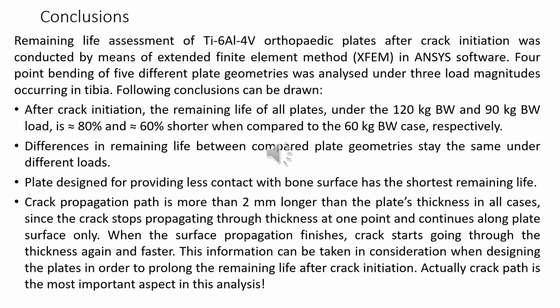Now for the conclusions, we may say that after crack initiation, the remaining life of all plates under 3 different body weights is very much different. 80 or 60% shorter, for example, when we compare 120 and 90 with 60 kilos.